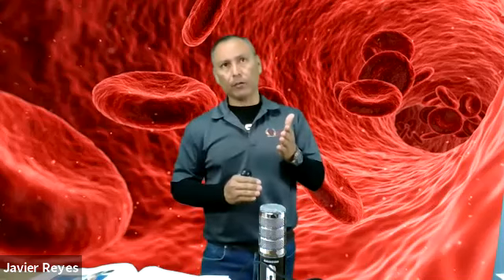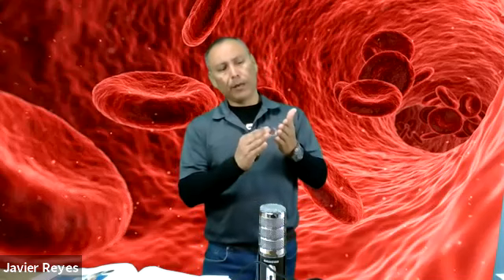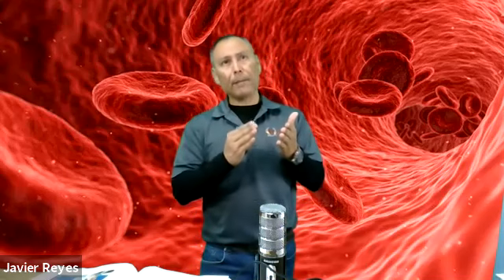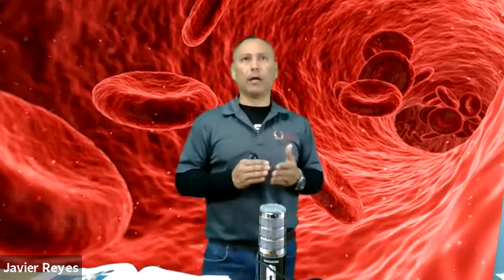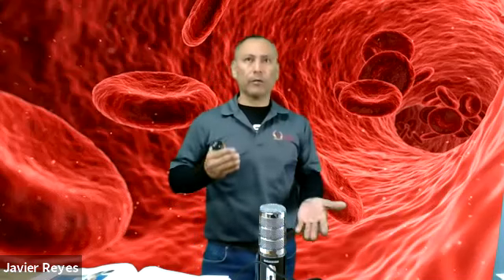So when you perform a puncture on a capillary bed, in this case, let's say the fingers, you will be collecting a sample with a mixture of arterial, venous, and capillary blood. Very important that you know that. So it's not either arterial or venous, it's a mixture of all these. So you have a lot of different kinds of fluids that you will find in this sample.